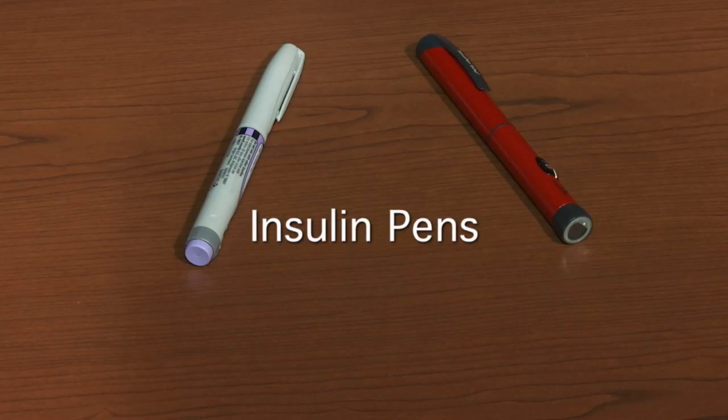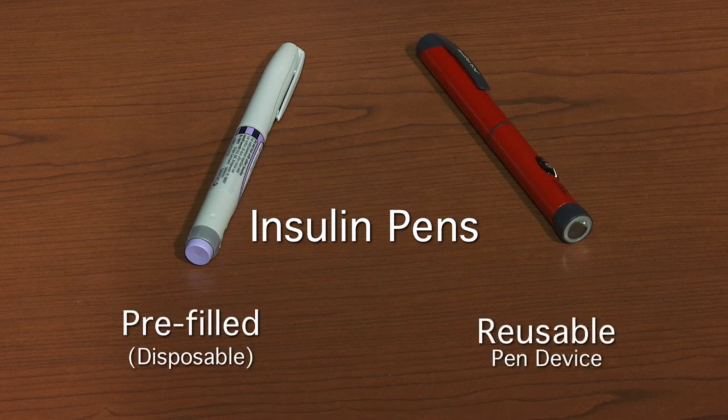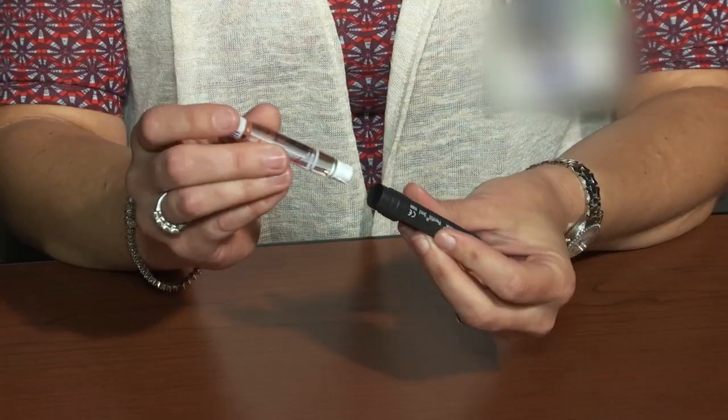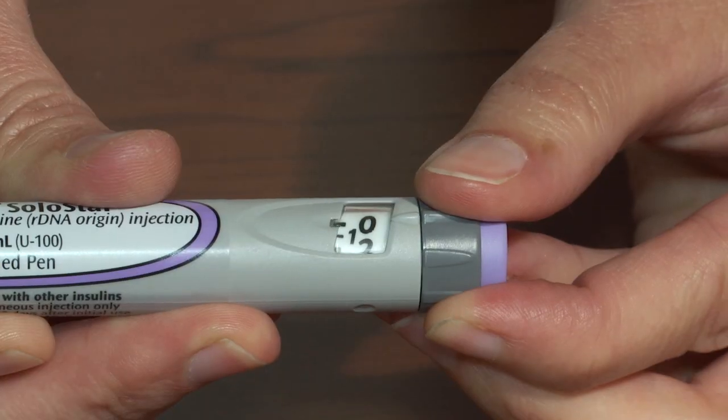There are two types of insulin pens: a pre-filled or disposable pen and a reusable pen device. Over the next few minutes you will learn how to prepare and use a reusable insulin pen device, as well as how to use a pre-filled or disposable pen to inject insulin.